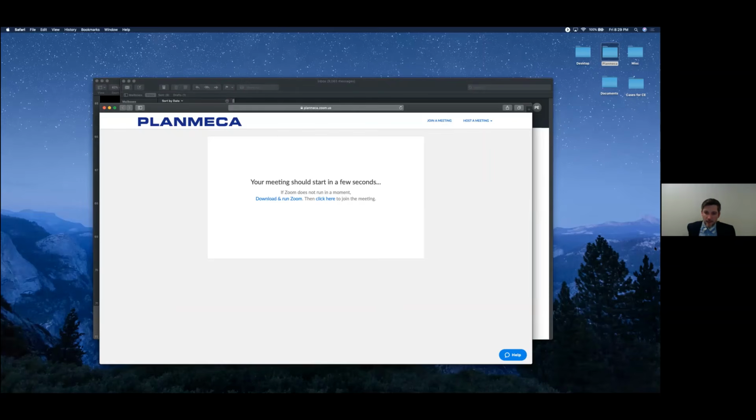I guess if it's not a patient of record and you can localize an emergency to a very particular tooth, you could just take a small field of view. And if you're looking for a root fracture, you could take it in HD mode if you really needed to. But for the purposes of overall diagnosis, I agree that a larger field of view would be sufficient.